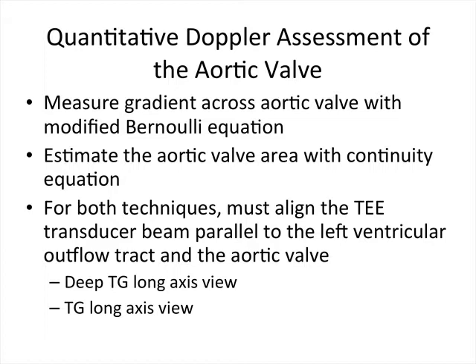Any probe adjustments must be done carefully, slowly, and gently to avoid injury to the stomach and esophagus. These views can be challenging to obtain and require practice and small adjustments to get the best image possible.